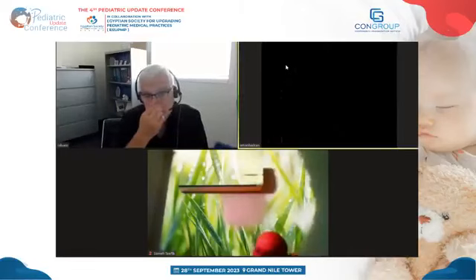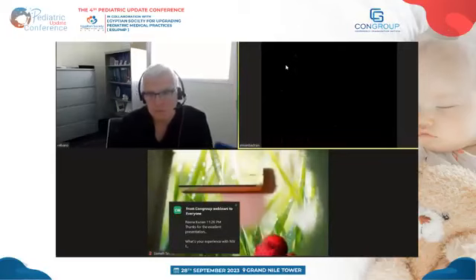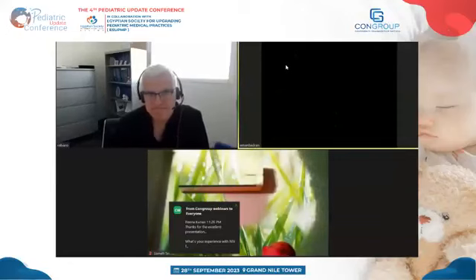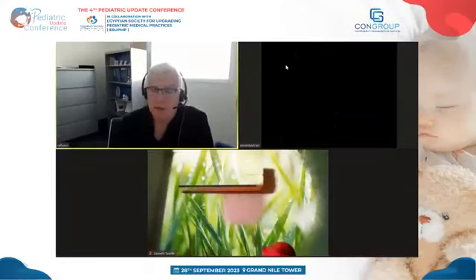Okay, thank you. Now, another question is how you feed the baby. Do you feed the baby on CPAP? Yeah, we do. I guess we're referring to feeding the baby orally, correct? Of course, we feed babies by tube on any kind of devices.